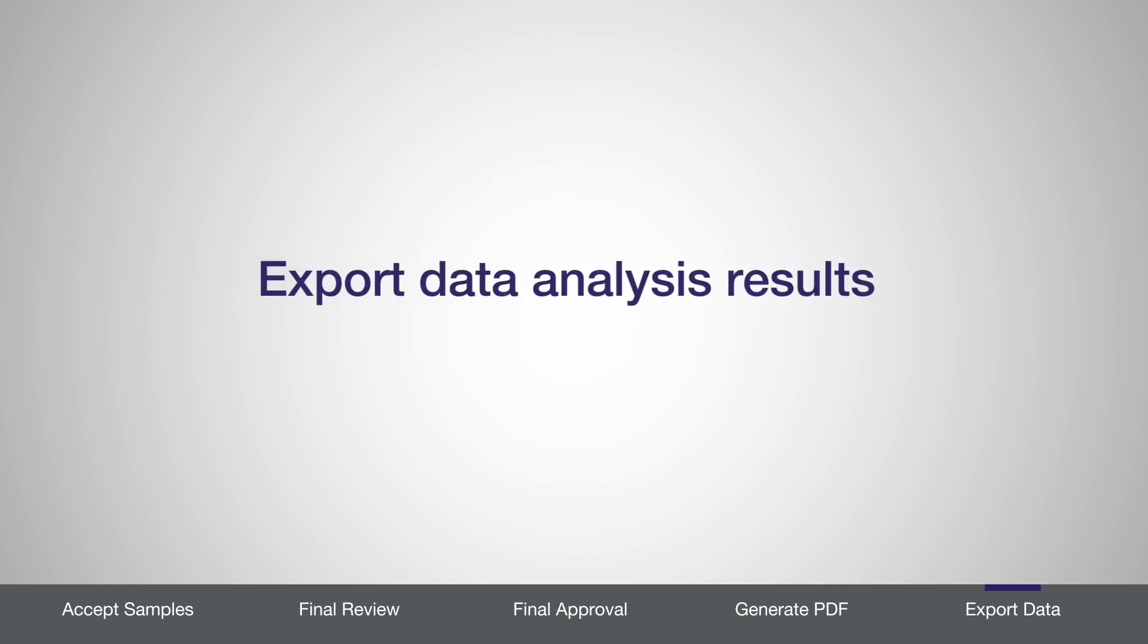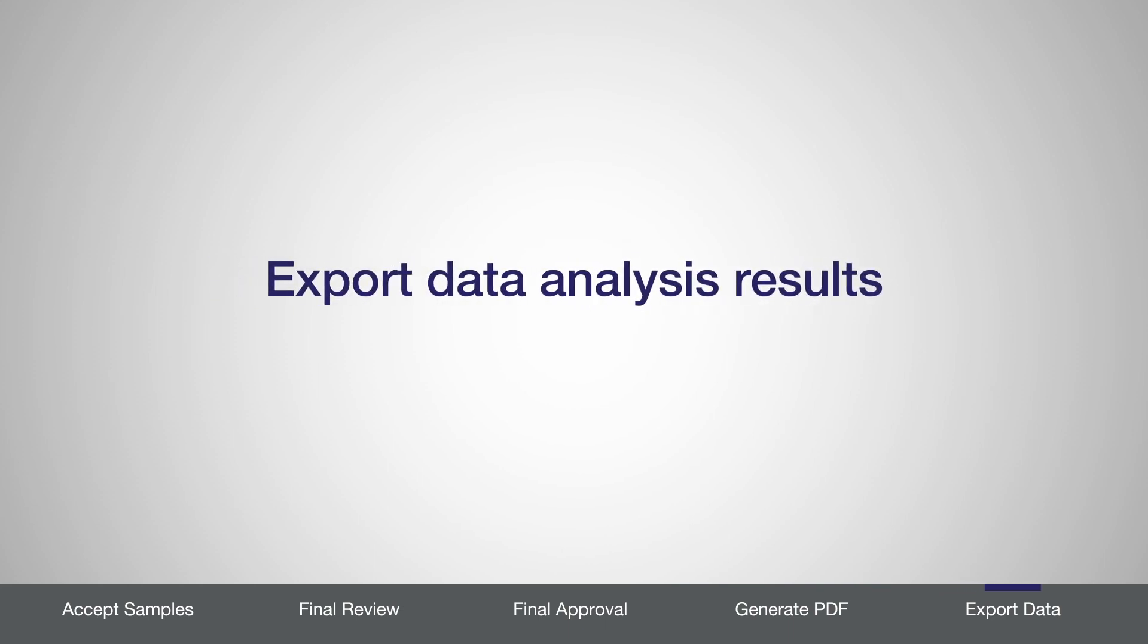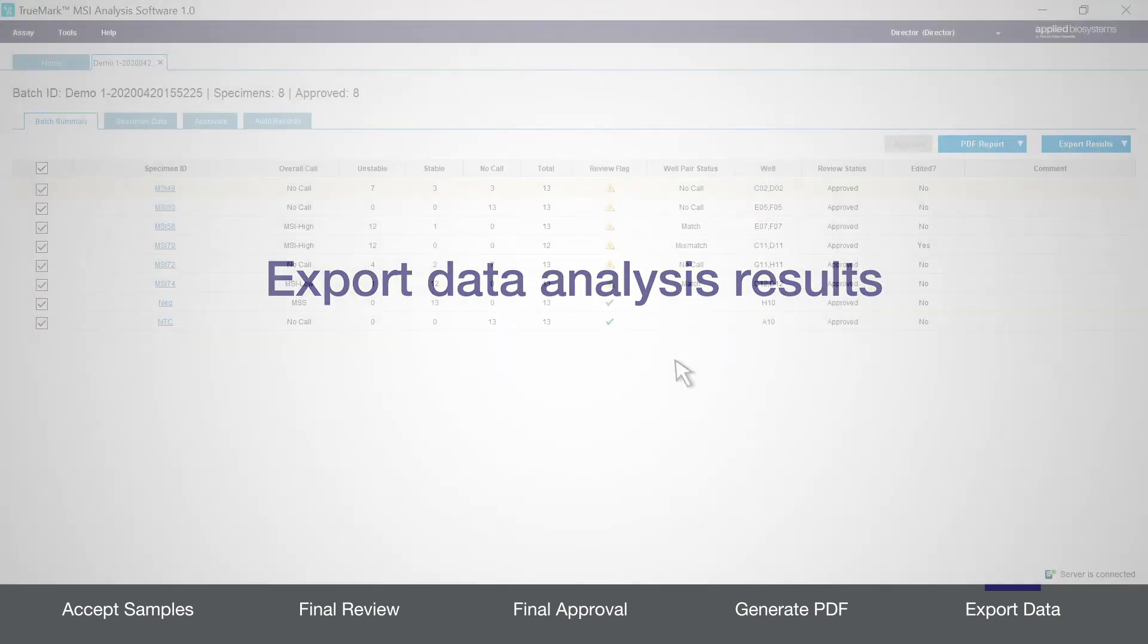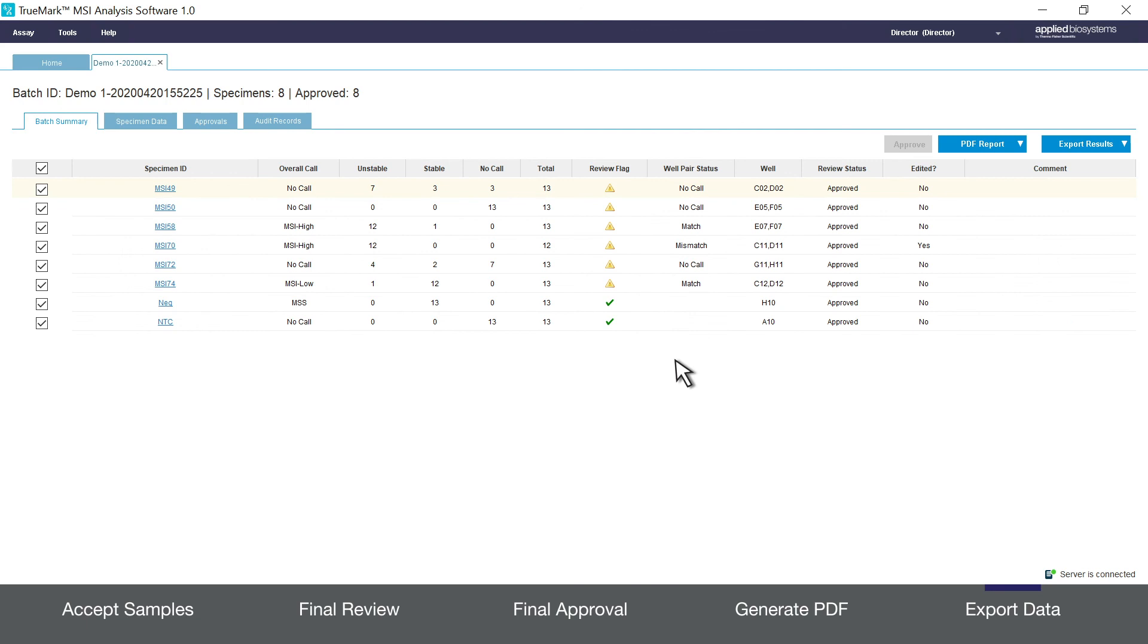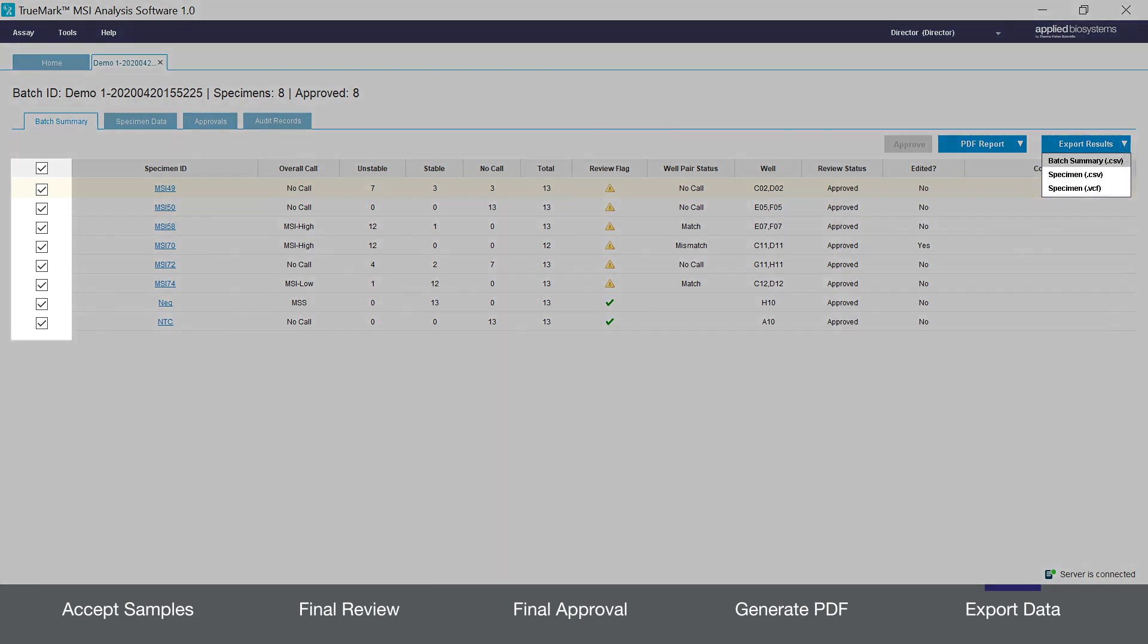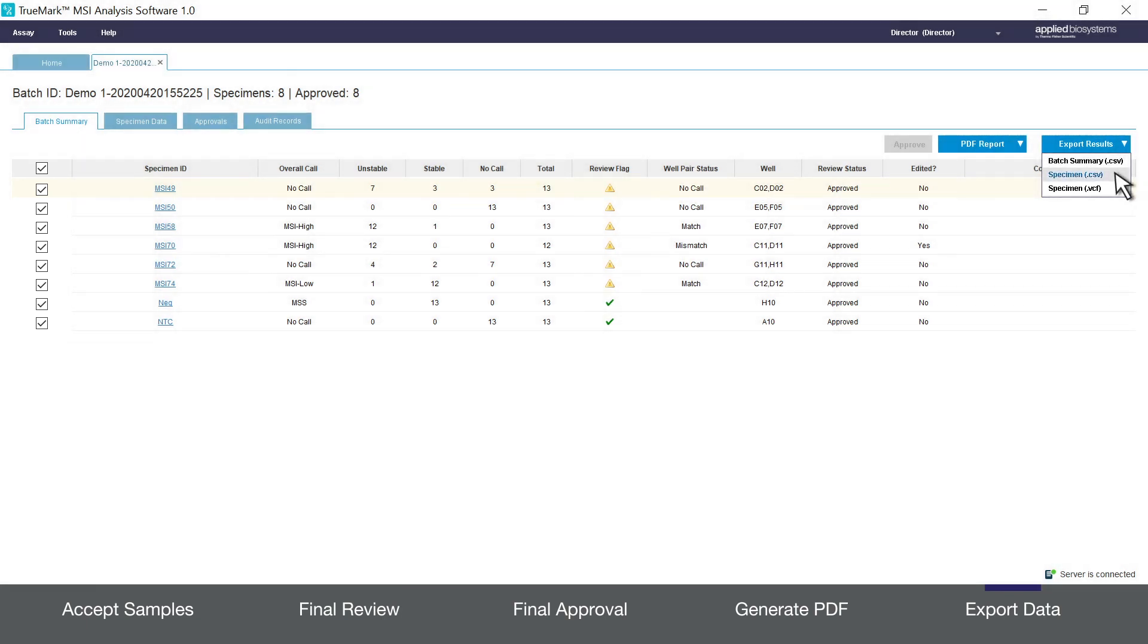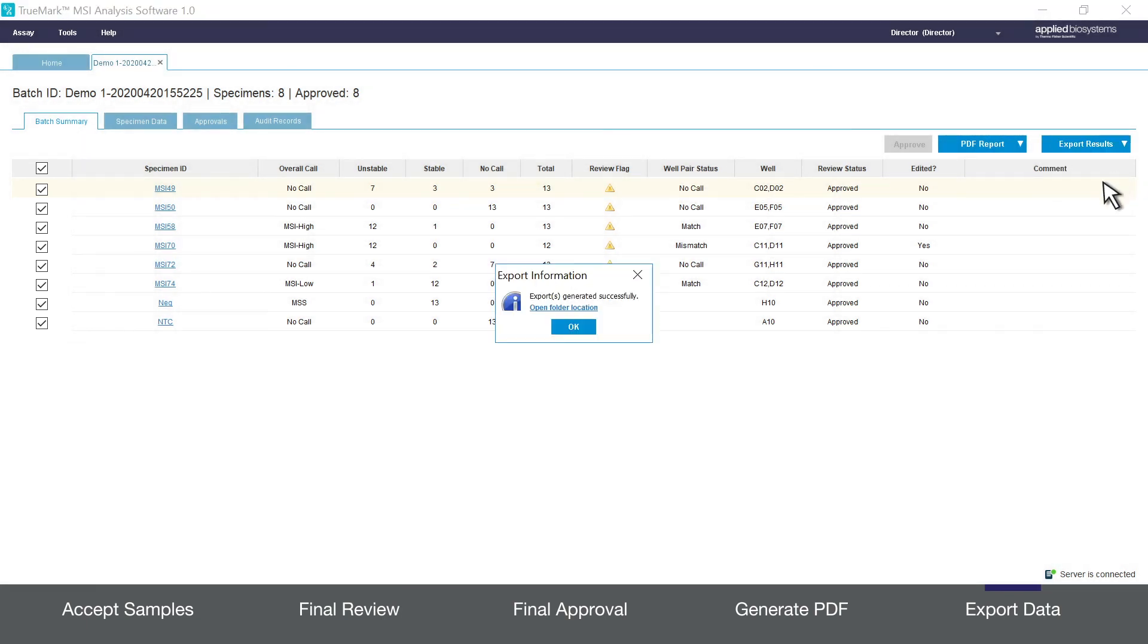Lastly I'll show you how to export your data analysis results. Again from the batch summary tab click export results and choose between three formats. Again if you choose either of the specimen options you must use the checkboxes on the left side of the screen. The software will notify you when your export files are ready and you can click to open the export folder.